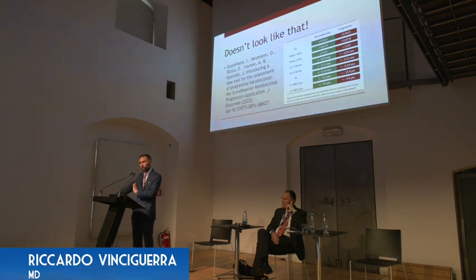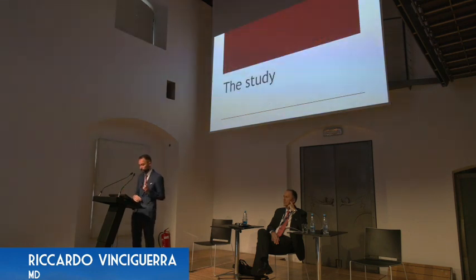I'm going to speak about the MS-39 later, and there is a reason, with 0.65 diopter Kmax change. So that's too little. If you have a patient with more than 49 diopters, then 1 diopter is not enough. You need 1.4 diopter Kmax change. To me, this is already quite disturbing, that we use one cutoff that is basically always wrong. If they are early, it is wrong. If they are advanced, it is wrong as well.